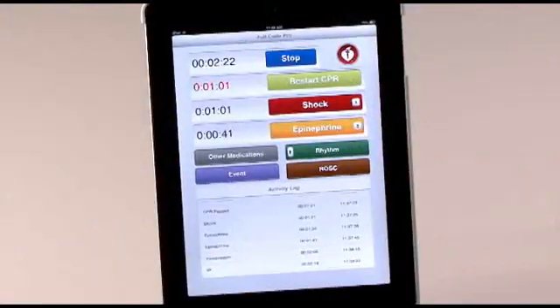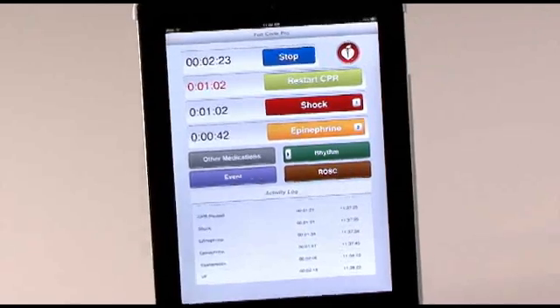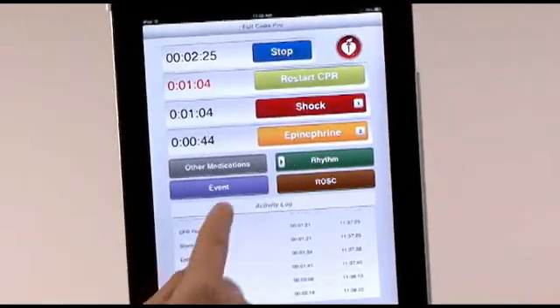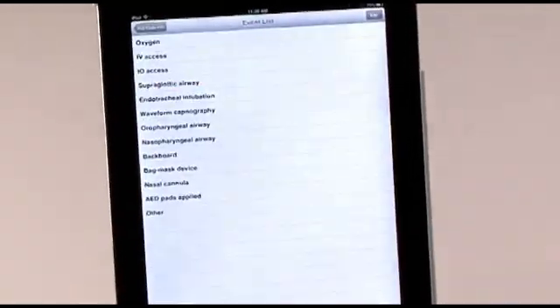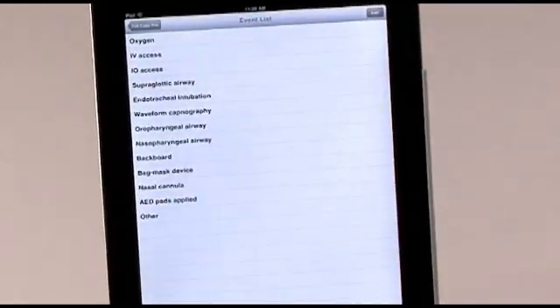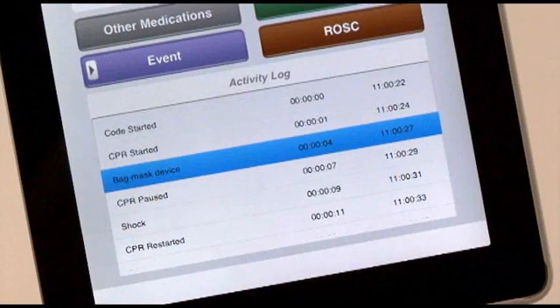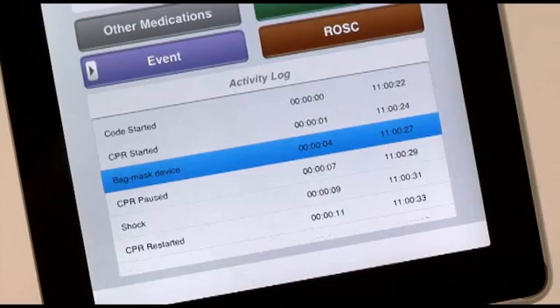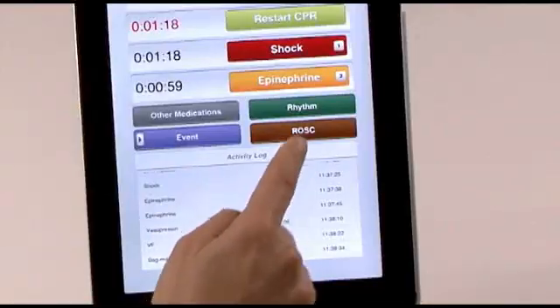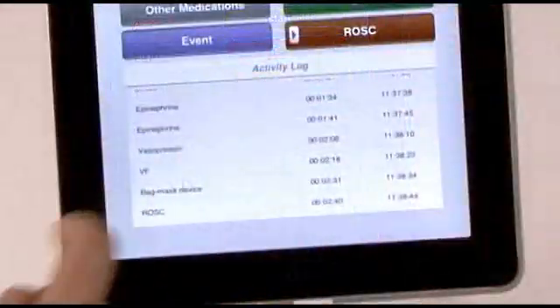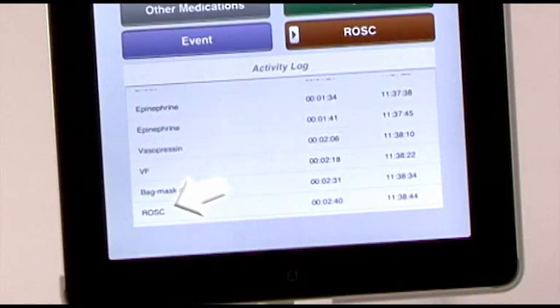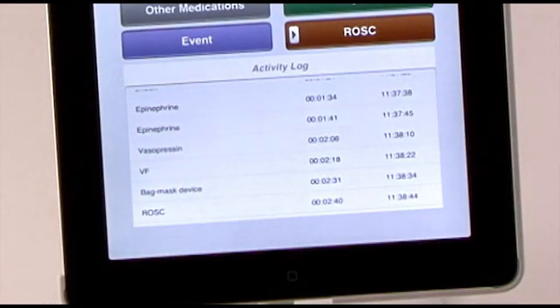The purple Event button displays a list of possible interventions and devices that might be used during a code. When you select one, it is recorded in the activity log. Selecting the brown ROSC button adds ROSC, or Return of Spontaneous Circulation, to the activity log.